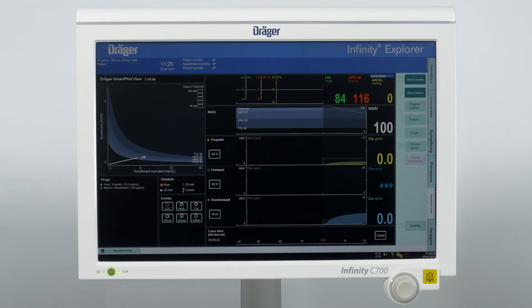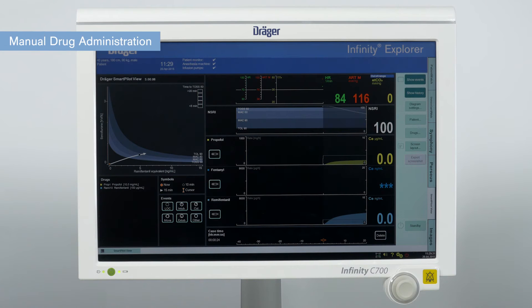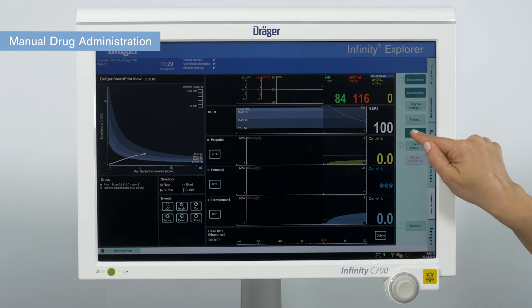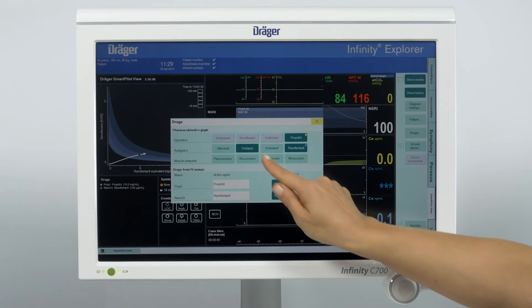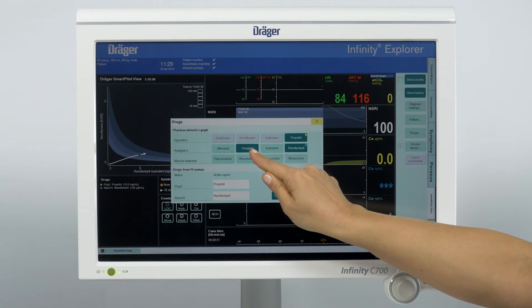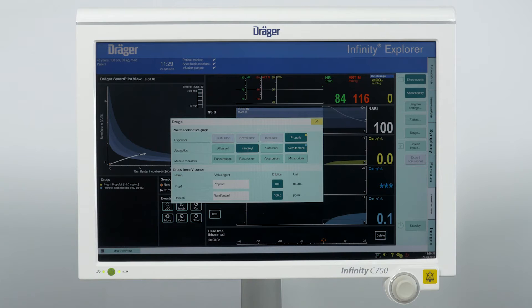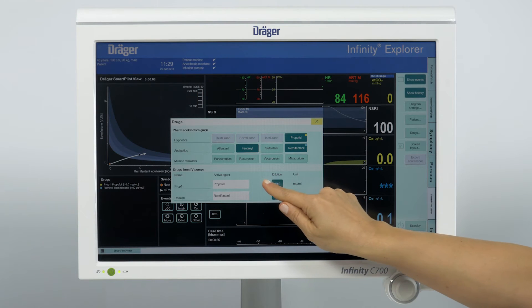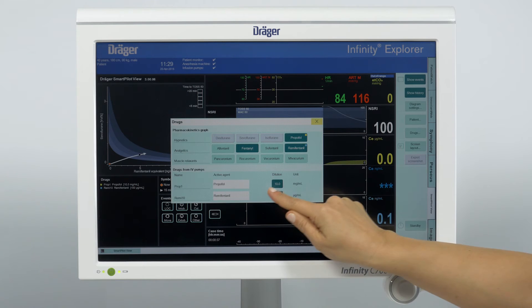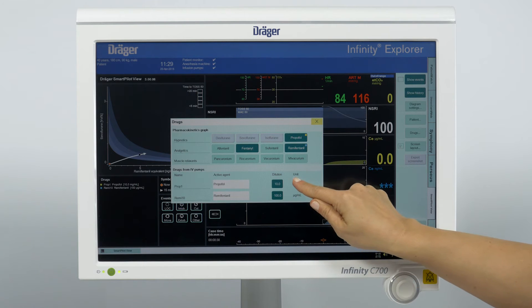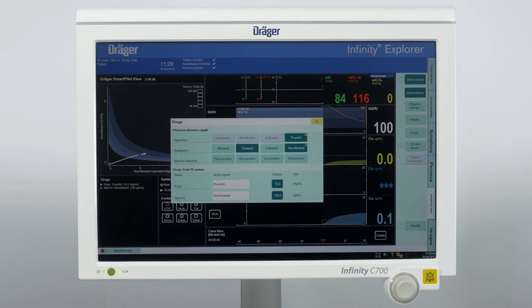If you have manual drugs to administer, go to the drugs tab on the right side of the screen and select the respective pharmacokinetics graph. The lower part will automatically list the drugs coming from the infusion pump with active agent name and dilution information. Close the drugs window after the selection.